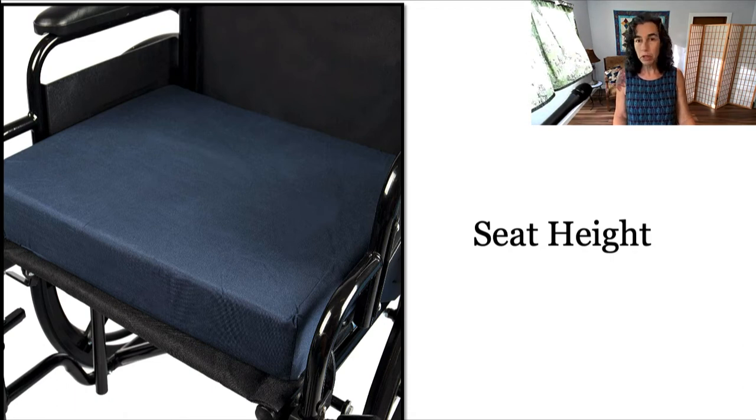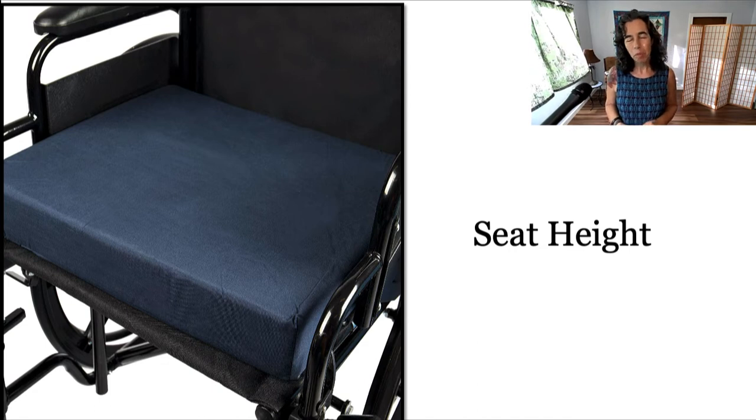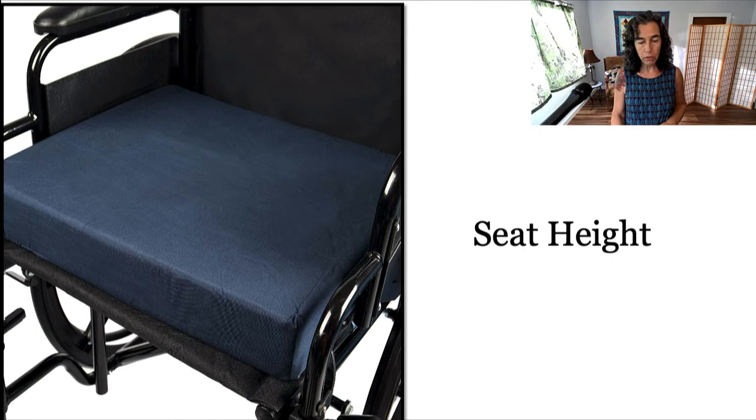Typically, there are some cushions in any facility, and we can help customize a wheelchair by putting in cushions. We also want to account for the height of the cushion when we're measuring for a wheelchair. So if a person is going to be using a seat cushion, we want to take that measurement into account when we're figuring out what size they need.